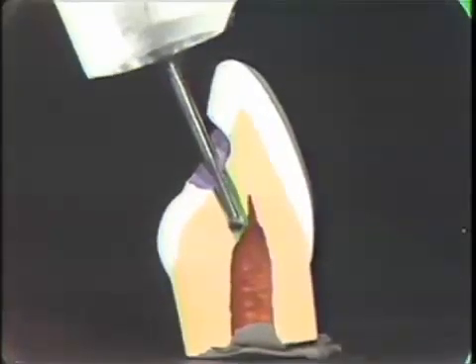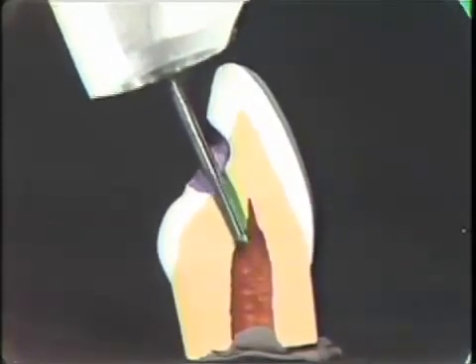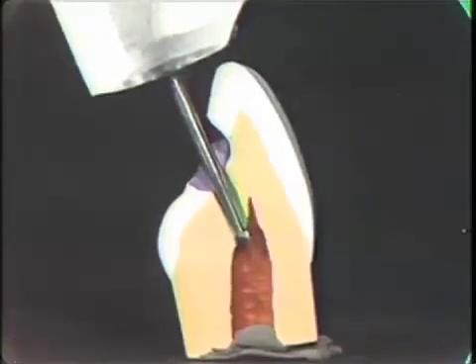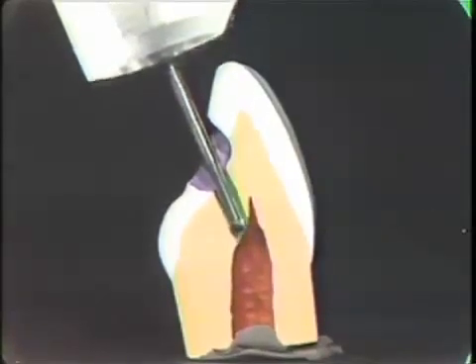You'll know when you get to the pulp chamber when you feel the burr kind of drop into the pulp chamber, as there's a reduction of cutting pressure on the burr.